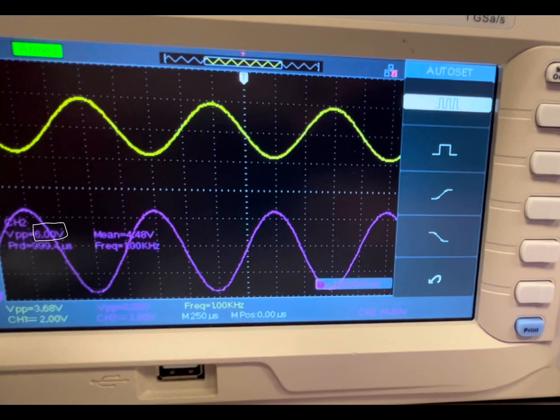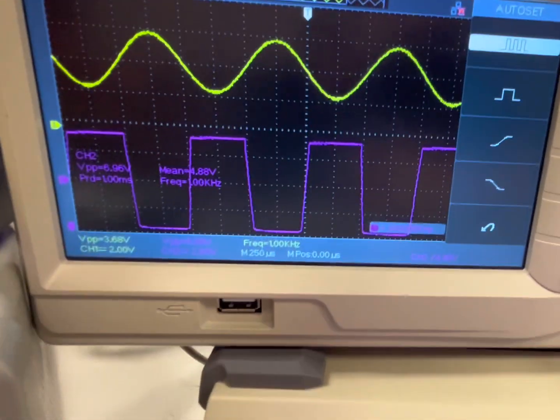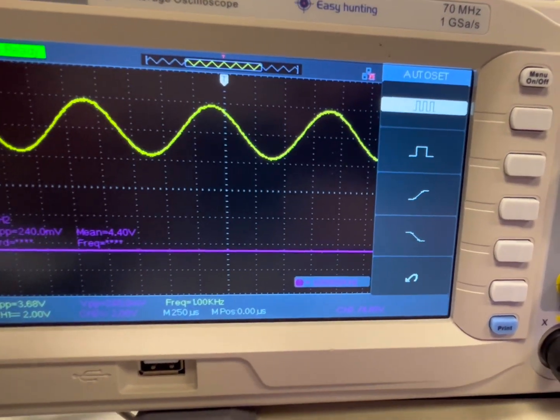There, we can get an output voltage of 6 volts. By turning the trimmer, we can see how the output waveform is affected. By adjusting the trimmer, the waveform output will be amplified, and at some point, the waveform will become saturated and be cut off.